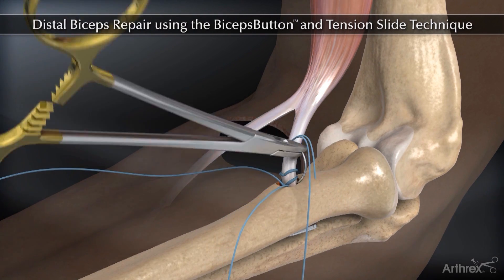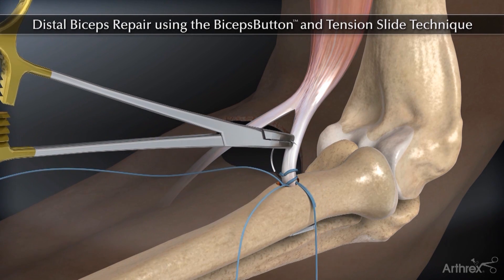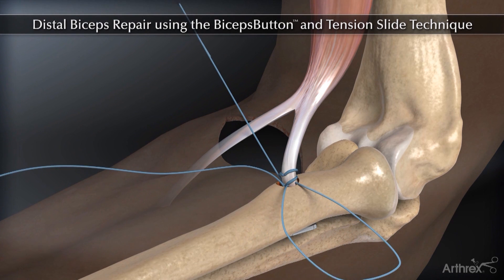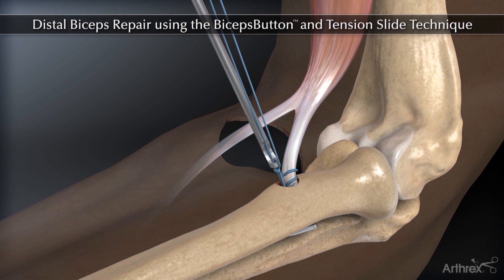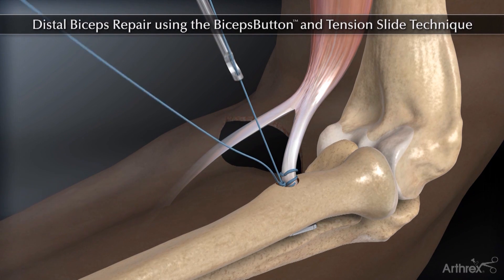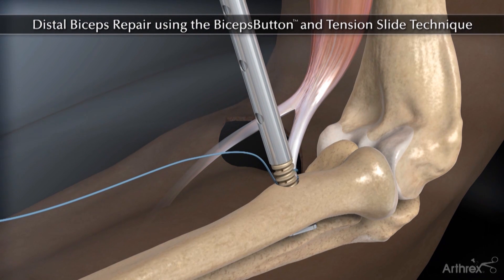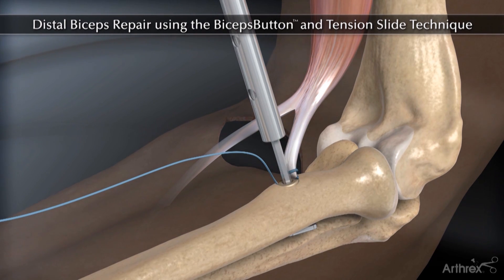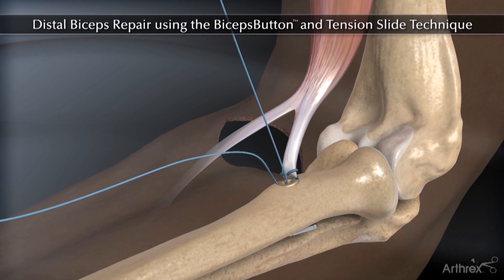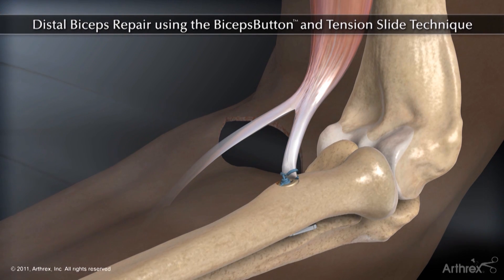Pass one suture limb through the tendon and tie a knot. Load one suture limb through the tenodesis driver and insert the screw on the radial side of the bone tunnel. Tie suture limbs to complete the repair.